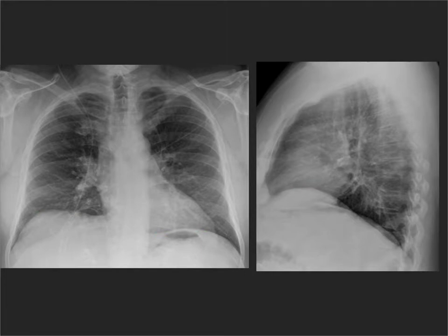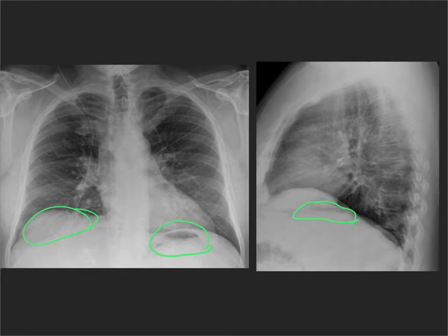The second easiest is when there's a large gas bubble, usually the stomach, under the left hemidiaphragm here. Although sometimes you can have a big loop of colon sitting under the right hemidiaphragm, and you can see that clearly on both the frontal and the lateral study — then that can identify which diaphragm it is.